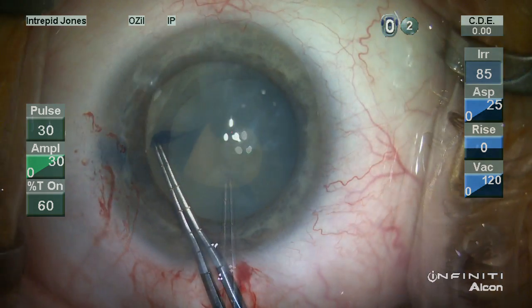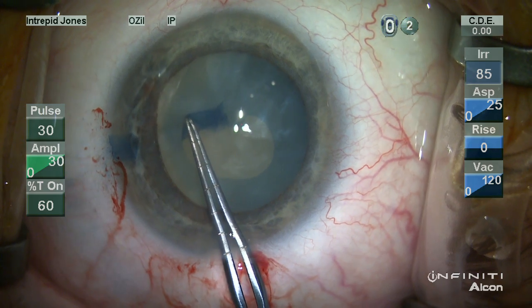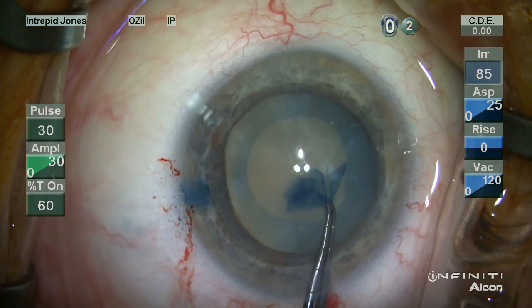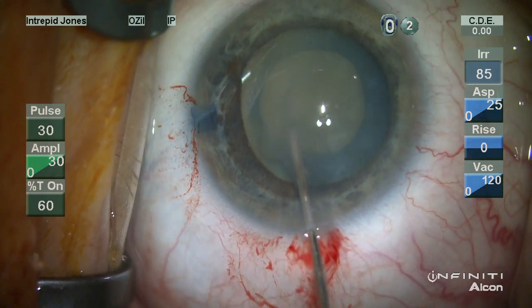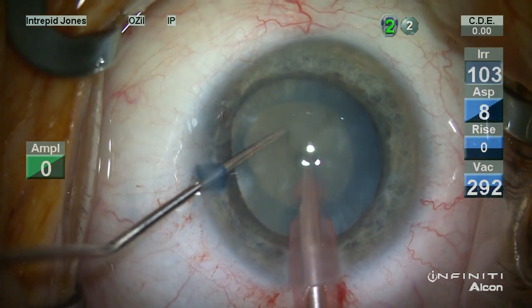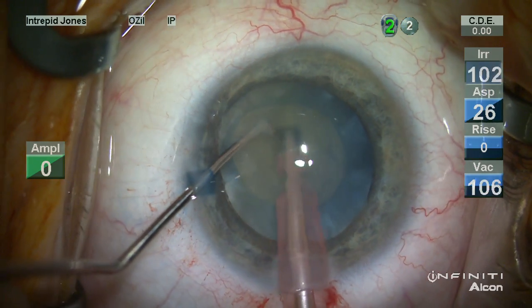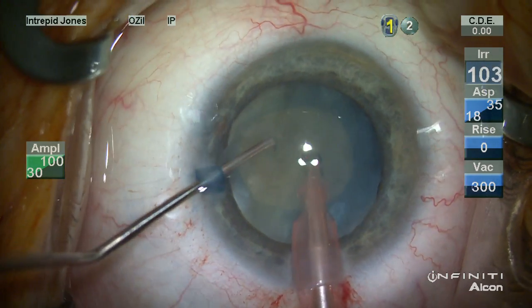The capsule is punctured and a small amount of liquefied cortex is aspirated, followed by creation of a continuous capsulorhexis that is small and controlled in size. This makes the opening safe to create and also very symmetric.